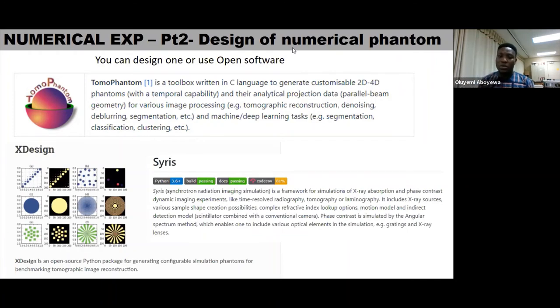They're just orthogonal to each other. So you can have 80 kV and 120 kV. Of course, that would bring in a lot of different things to consider, like the heating and all of other stuff. And so people do it like they have two detectors set up such that they rapidly switch the energy of the source, so that two different detectors can pick it up.